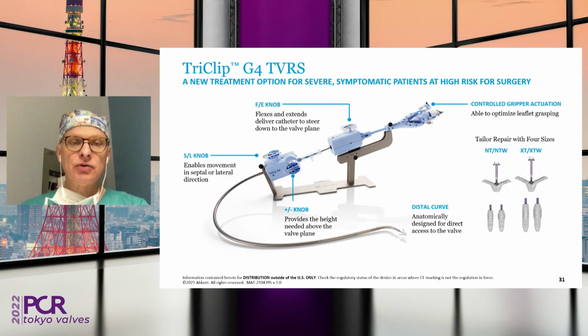Yeah, so as you have seen, the delivery system has been upgraded to be used in the tricuspid space. We have been using MitraClip delivery systems in the past, off-label, for treating tricuspid regurgitation. And there were several limitations. The two main limitations have been the tendency of the delivery system to fall into the tricuspid annulus.